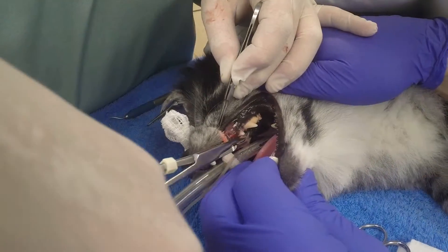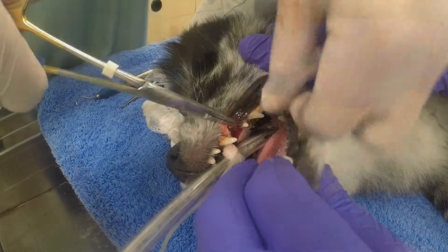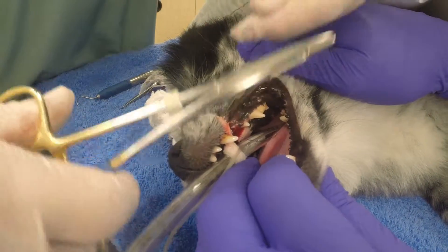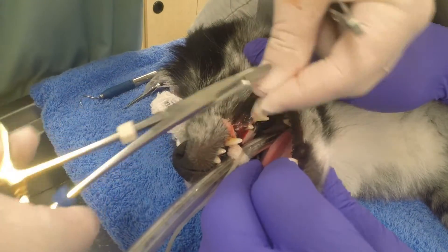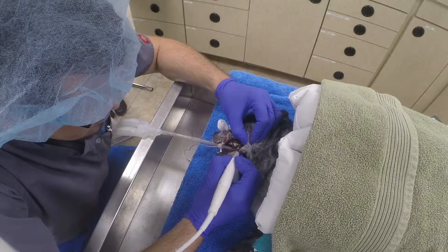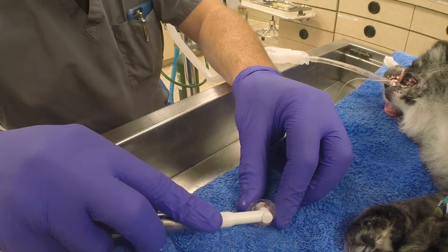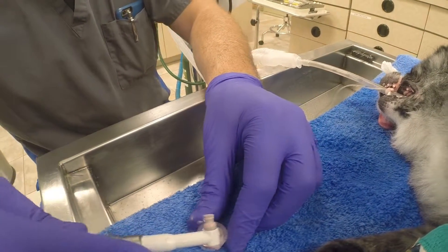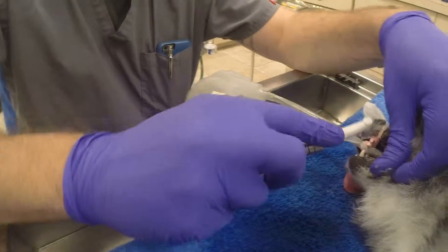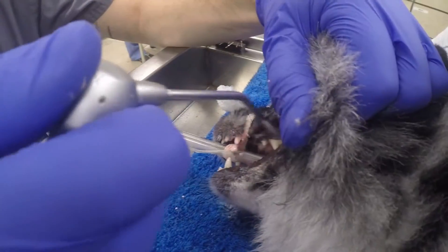The gum is then closed with suturing. This prevents any food or material from getting up into the pocket until it can heal. After suturing is complete, the teeth are cleaned with a high-speed water-cooled scaler and then polished with a high-speed polisher, much like we have in the human dentistry field. After this, a sealant is applied to the teeth that lasts several weeks.